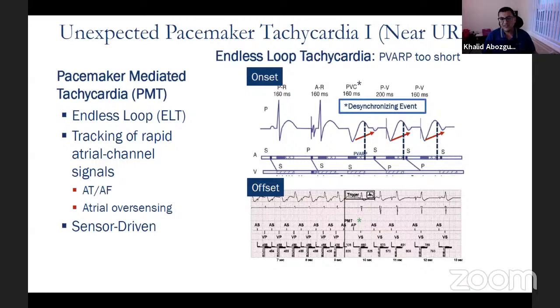It's really whether the lead is MRI compatible or not, and whether the whole system is. Sometimes the lead itself is MRI compatible, but just because it's been implanted with a different device, both companies will say that this is not MRI compatible, which is not true. I think the question you really need to ask yourself is, if you're requesting an MRI and you have too many leads, is the MRI going to be useful?